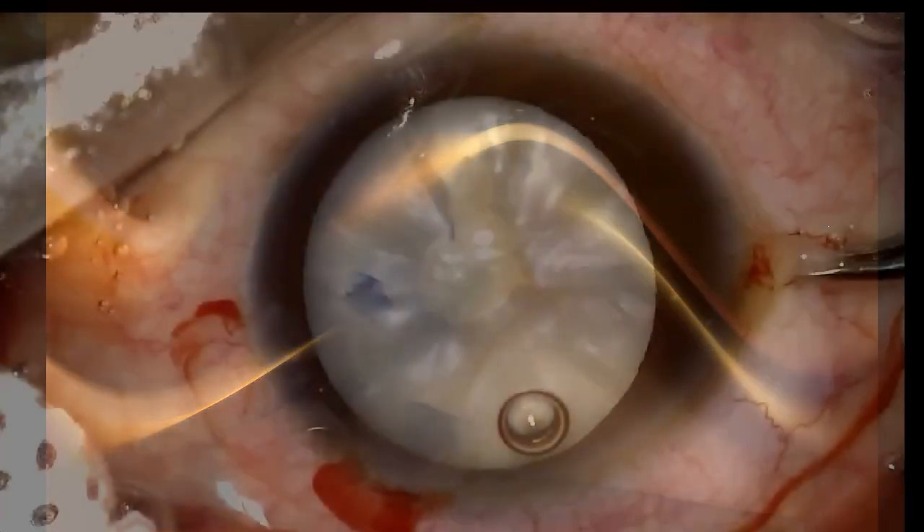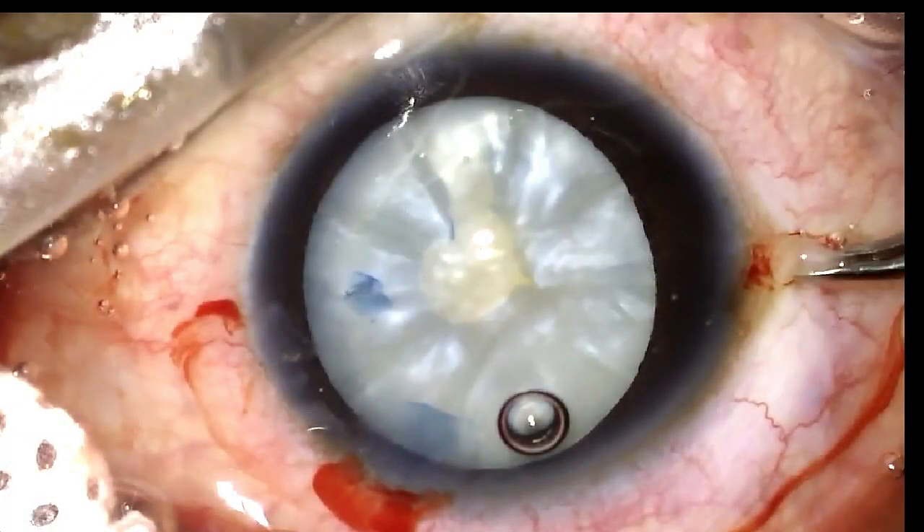Let's now move to the surgery. Typically in a patient with an intumescent cataract, I perform a small capsular rhexis, decompress the capsular bag, and then proceed to completing the rhexis. In this case, whilst performing the smaller inner rhexis, the rhexis has extended to the periphery at the 6 o'clock position.